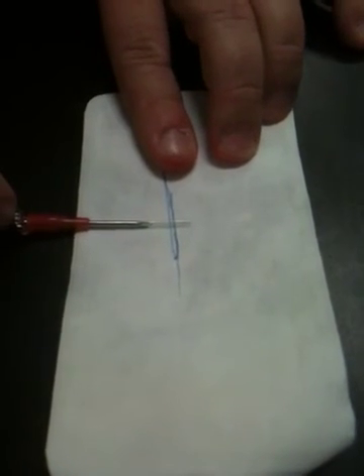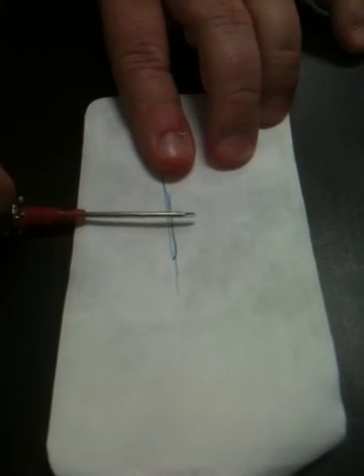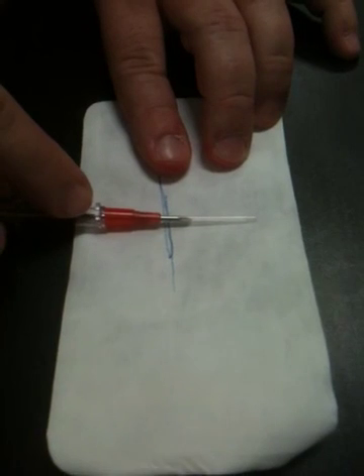So hopefully that'll explain what we mean by feeding the cannula off of the needle versus pulling the needle back.